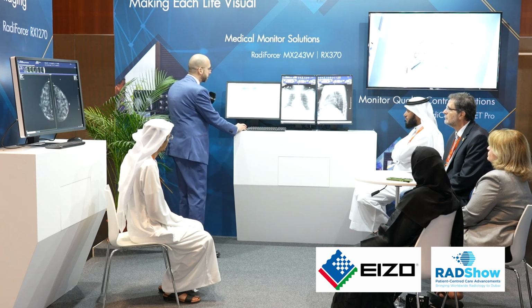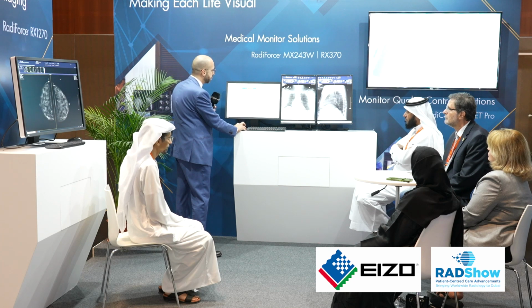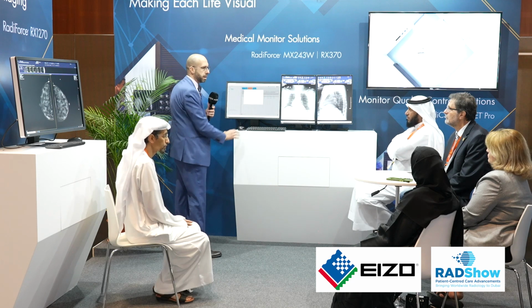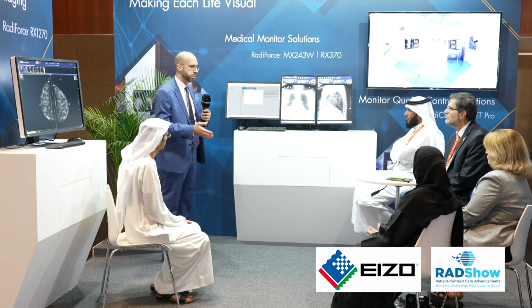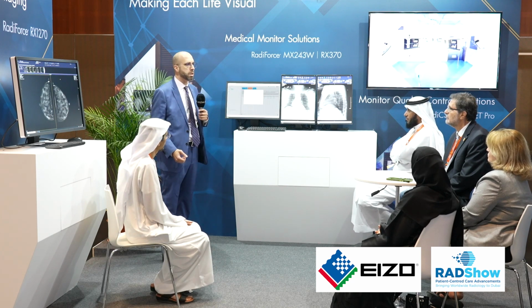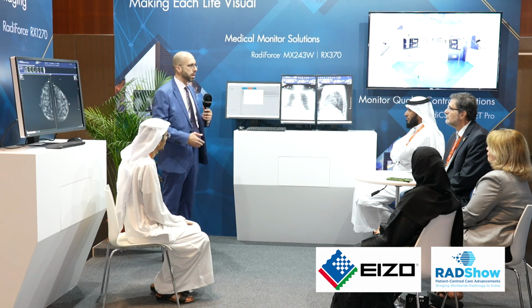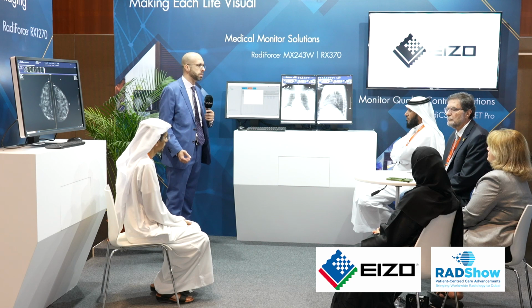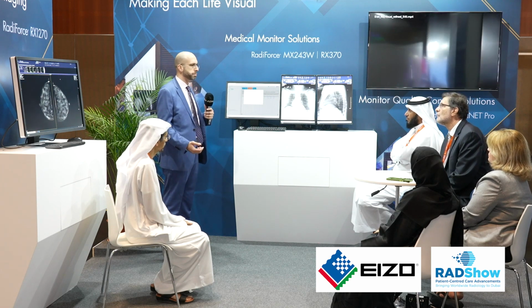And then we can retrieve the reports and download them as CSV files to the computers, so that you can use them in case you have any accreditation body coming over to check the quality in your establishment.